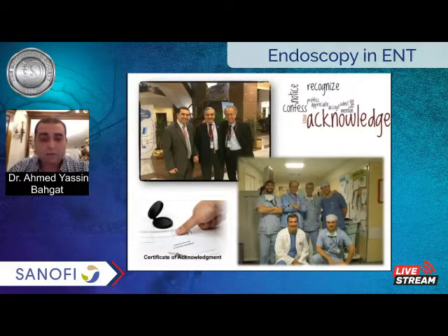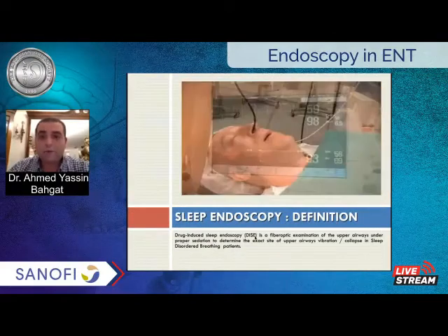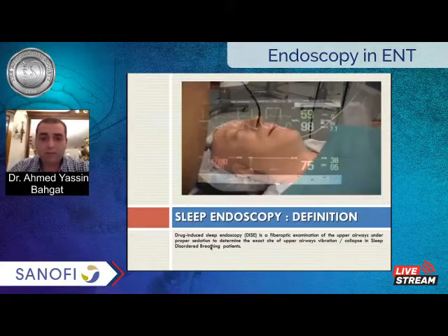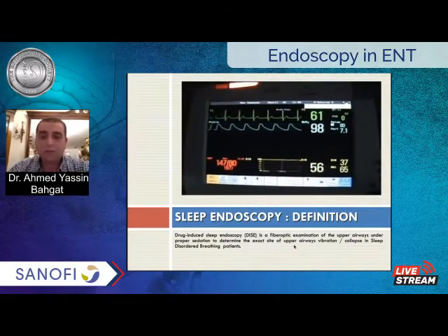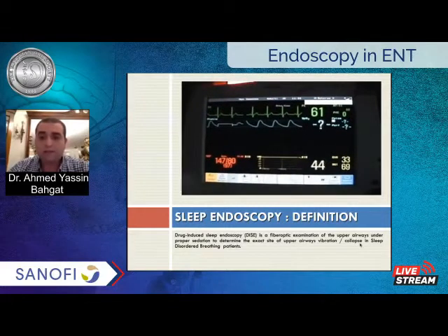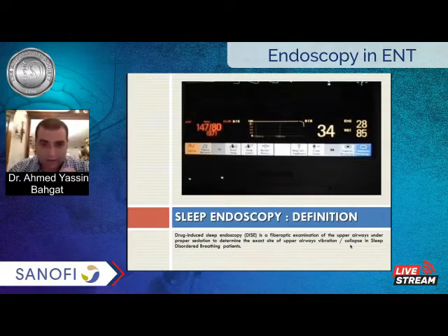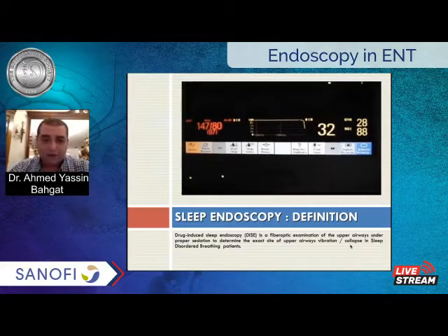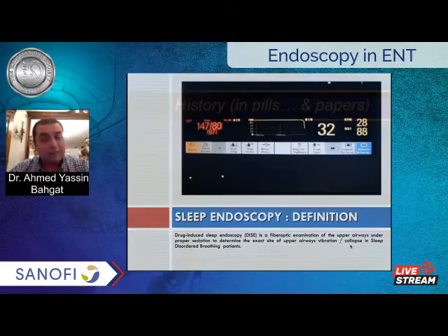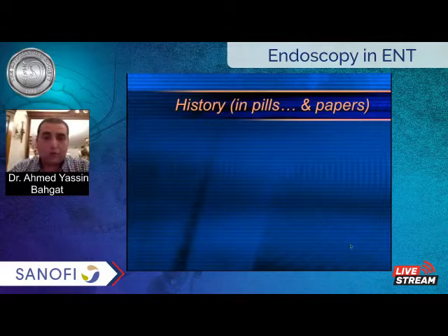So sleep endoscopy, or what's called drug-induced sleep endoscopy, DISE, is a fiber optic examination of the upper airway under proper sedation to determine the exact site of upper airway vibration in case of snoring, and upper airway obstruction or collapse in cases of obstructive sleep apnea patients. So it's a tool to detect the site of obstruction. It's not like a sleep study. A sleep study detects what's going on during sleep as regards quality, but sleep endoscopy is just to see the anatomy, what's going on in the upper airway.